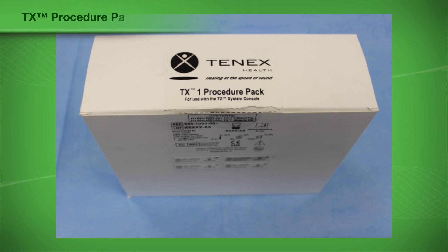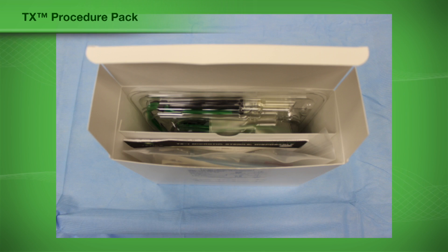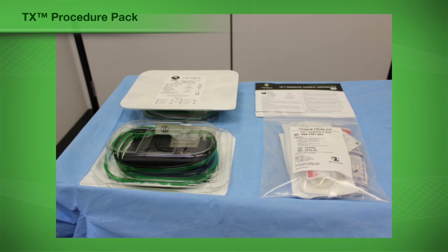The disposable TX procedure pack includes two trays which contain items used during the procedure. The instructions for use, post-procedure patient instructions, and physician dictation template are packaged between the trays.